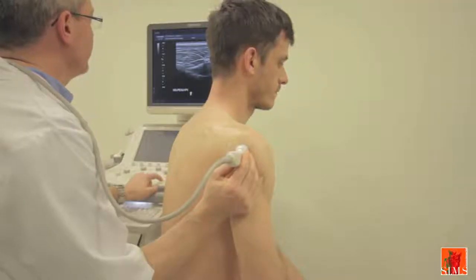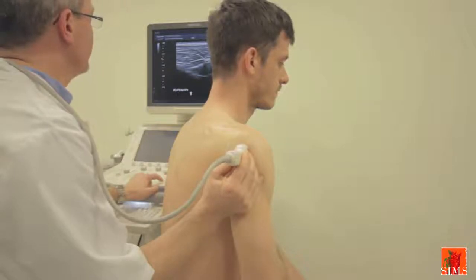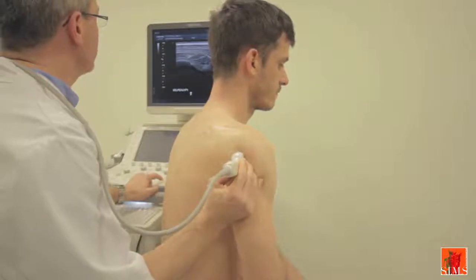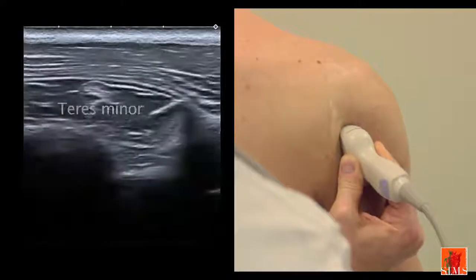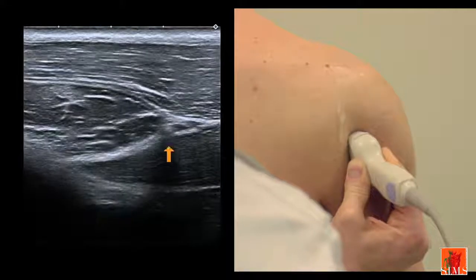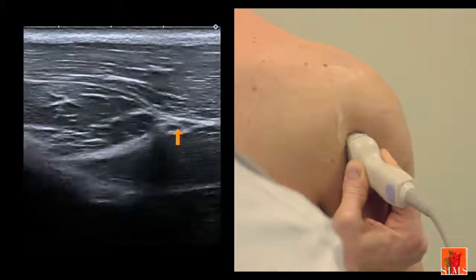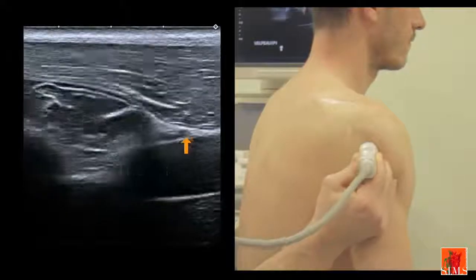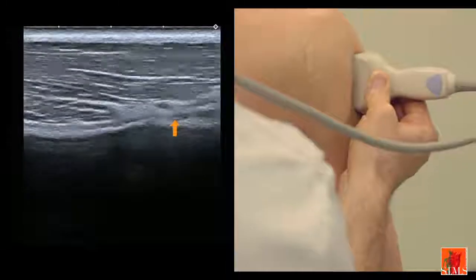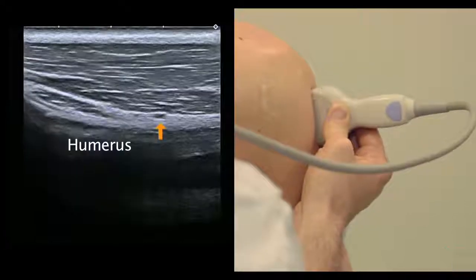We will now attempt to identify the axillary nerve at the level of the quadrilateral space of Velpeau. We locate the teres minor as on the previous images. On the immediately inferior part of the teres minor, which forms the roof of the quadrilateral space, we individualize a neurovascular pedicle. With the triceps deep to it, all we need to do is turn around that pedicle to see it circle the diaphysis of the humerus — here is the small artery, and here probably is the small nerve.